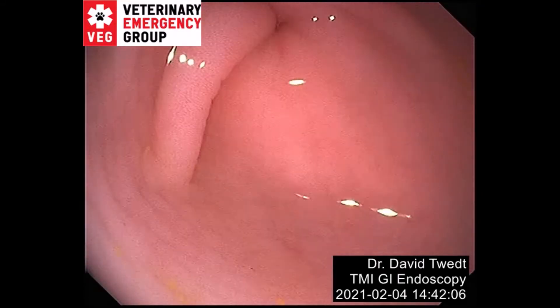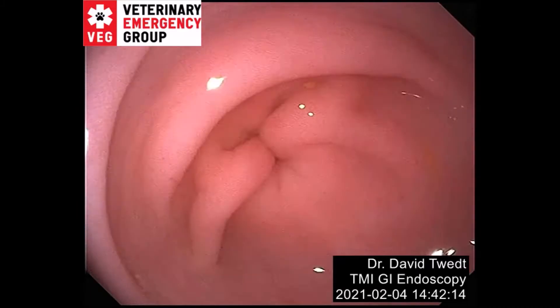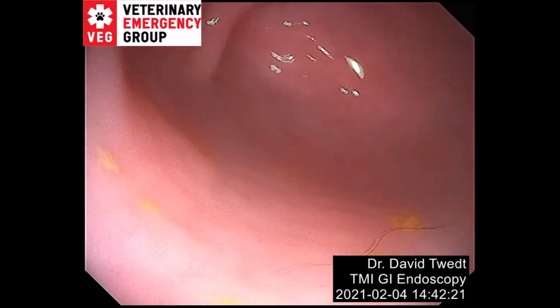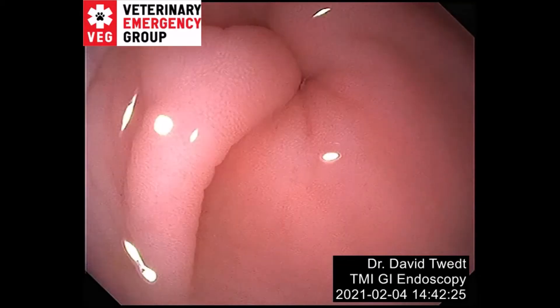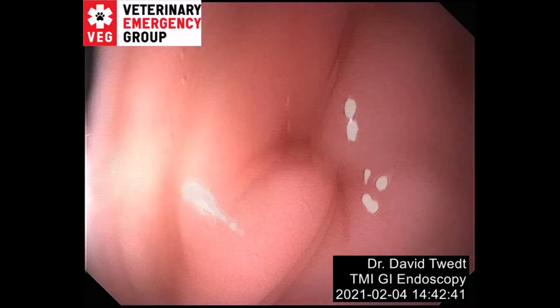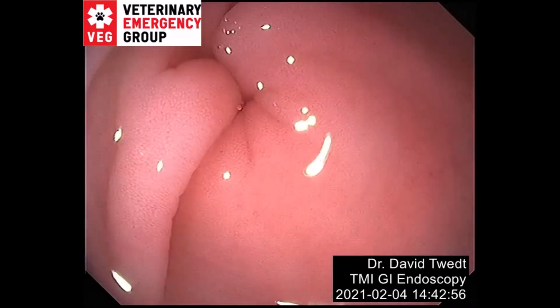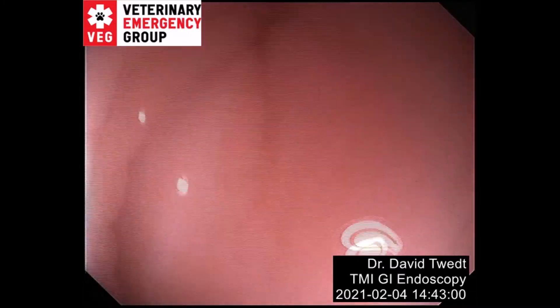Even looking at a pylorus, I have a plan — do I want to come from the bottom up, or from the top down? Look at that ridge over the pylorus. It would be terrible to try to come at it from the top, so my plan will be to approach it from the bottom. The whole skill of the pylorus is being able to hold it in the middle of your screen. It's going to want to move up one way or another, and usually it'll move in a stereotypical manner — as you get close, every time it will jump down. That becomes part of your plan: if it jumps down, come from a little of the downside so it jumps into you.